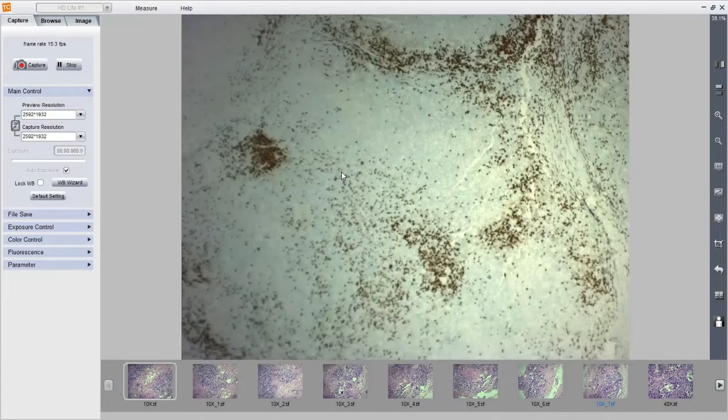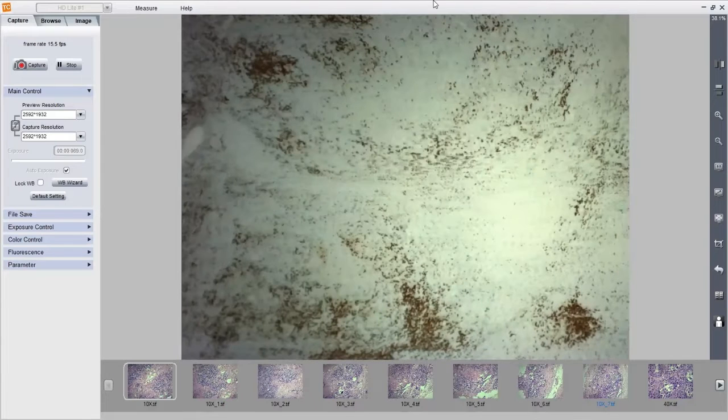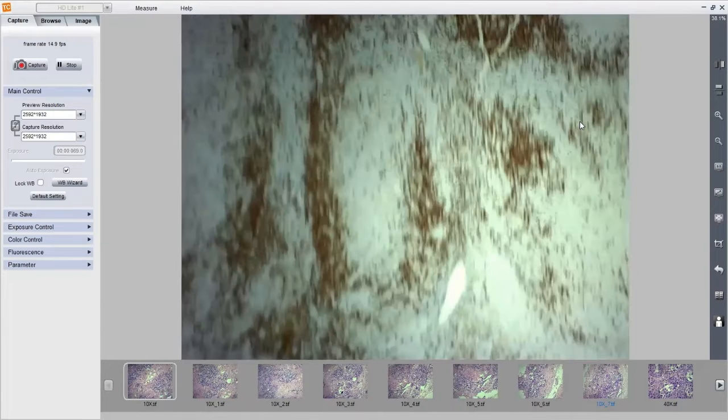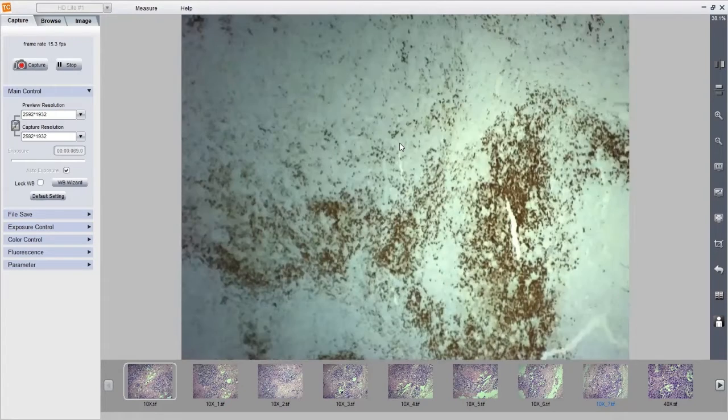Okay, so these are the B cells. But I'm not happy just seeing that there are some B cells. I want to see what the expression of CD20 is in the large cells, whether the large cells are CD20 positive or negative. Shall we go and see? Negative.